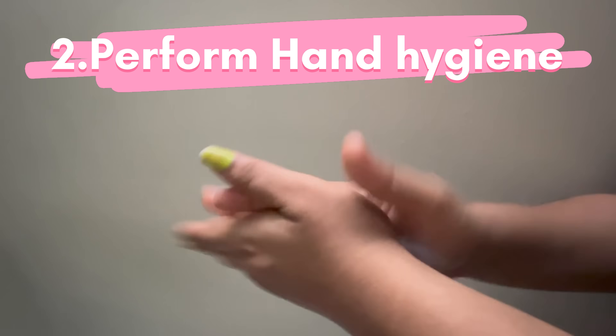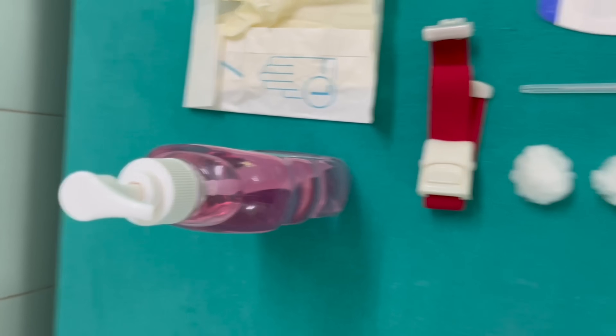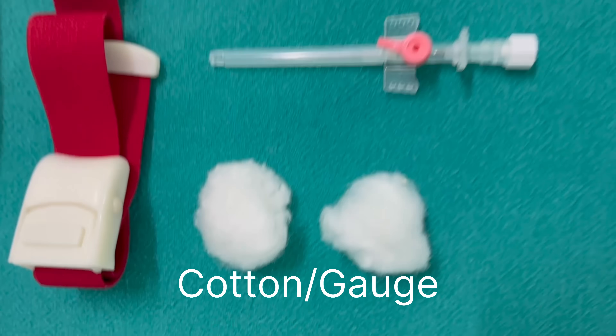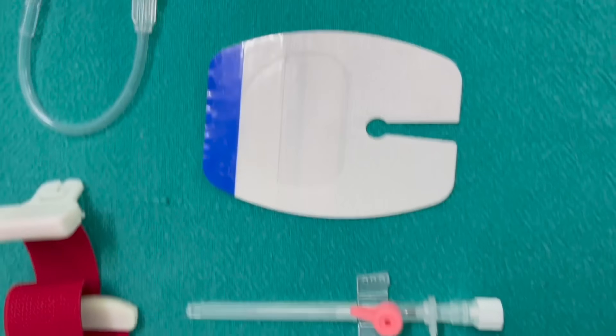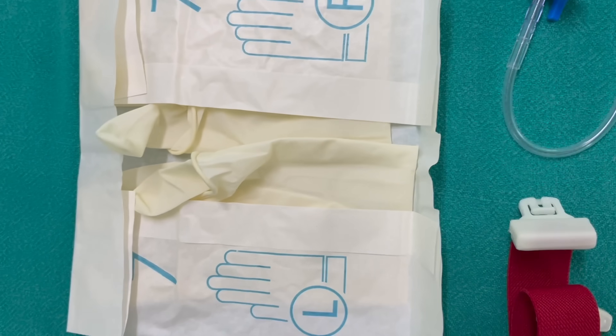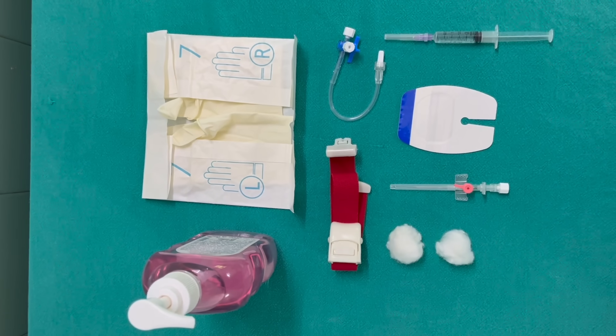Perform hand hygiene with soap or alcoholic hand rub. Then prepare the equipment. The equipment includes a tourniquet, cotton or gauze base, an IV cannula, a dressing or cannula fix, a 2ml syringe, a 3-way stopcock with 10cm extension, and a pair of gloves.